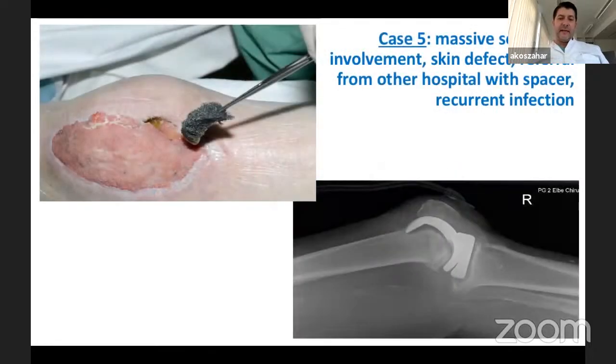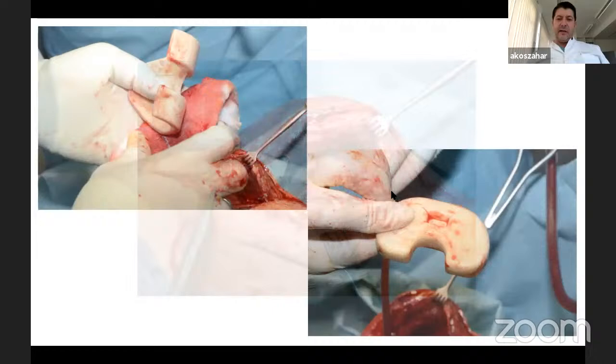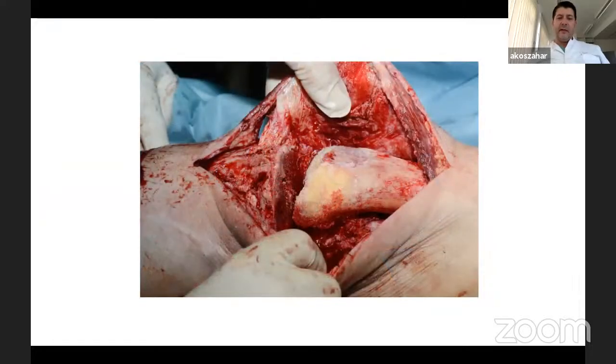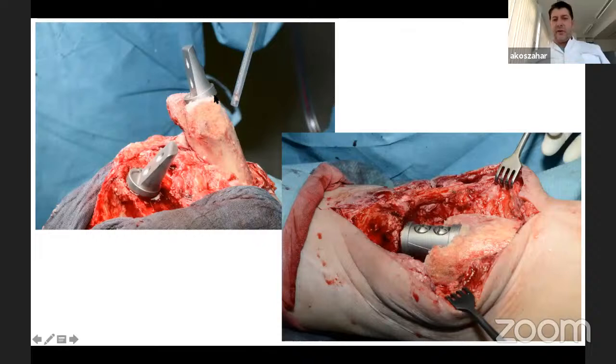Of course, you have to know your limits. Not everything is possible with the septic revision when you have cases like this, several operations before, spacer didn't work, very bad soft tissues. You have to remove the spacer. You have to remove a lot of soft tissues. You have to remove a lot of bone. The bone quality is very bad. The blood supply is very bad. You have to resect the extensor mechanism. In these cases, you have to go for arthrodesis or amputation, above knee amputation. Nobody is happy. In the young patient, above knee amputation is maybe better. In the older patient, arthrodesis is maybe better, because the life with a stiff knee, with an arthrodesis knee, is not so nice.